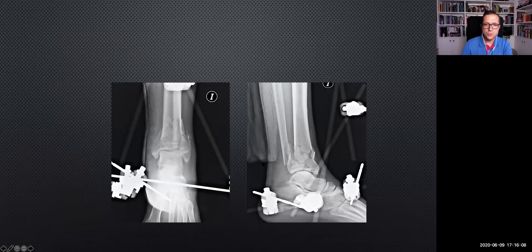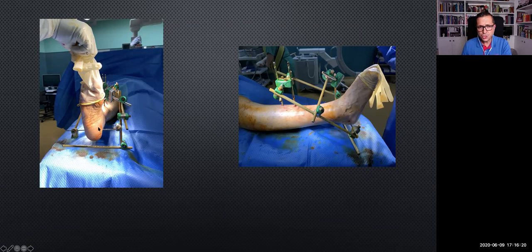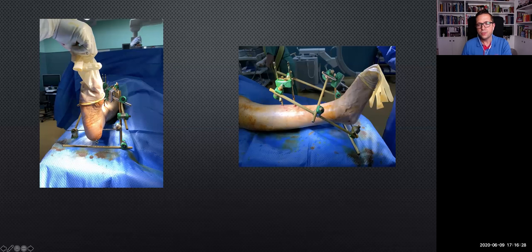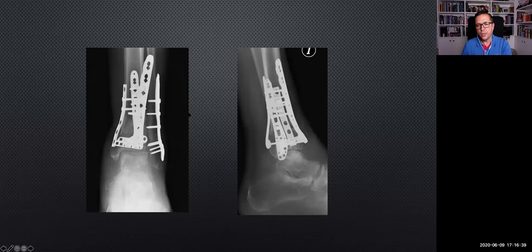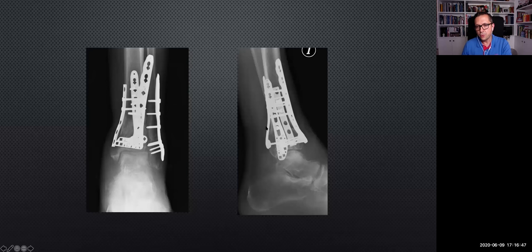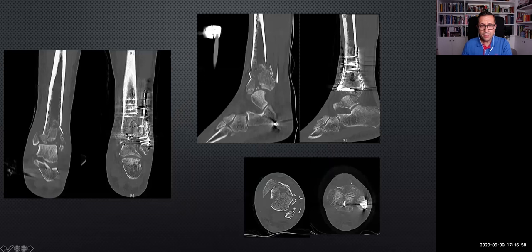Another comminuted case — after the ex-fix, look at the comminution. This is our delta frame configuration; sometimes we use an extra element to avoid bed sores at the heel. The CT scan shows a lot of comminution and a central defect. After two to three weeks, definitive fixation again — plate configuration from a posterior approach. You see the anterolateral, the posterior, the medial column plate fixation, and the anatomical plate for the fibula. Even in this very tough case, we can nicely restore the joint line.